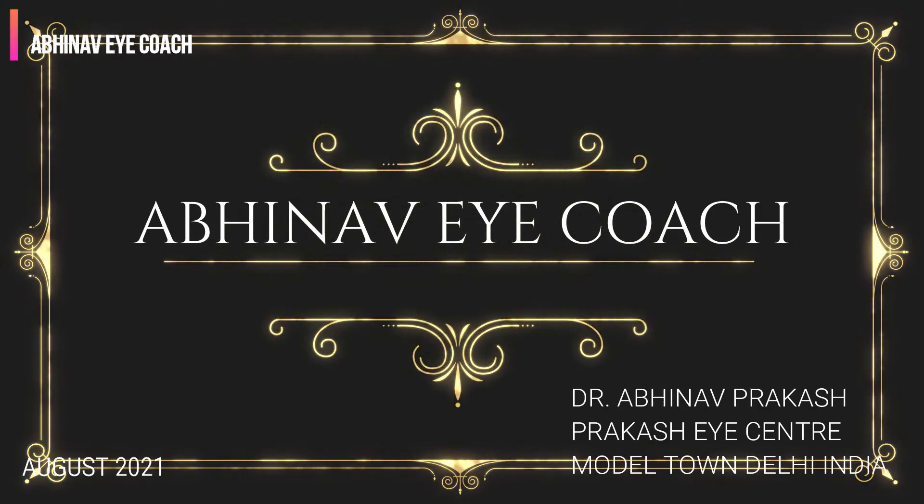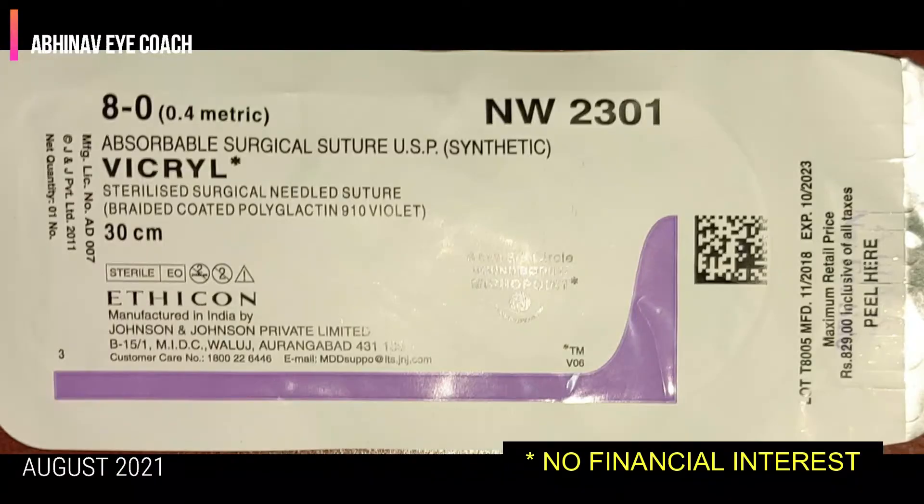Hello friends. Today I am going to show you the surgical technique of trabeculectomy with Mitomycin C and releasable sutures.